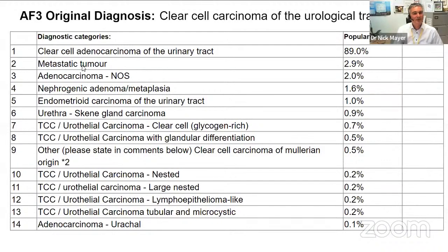But this was in a diverticulum, so I think it'd be harsh to call that 0, but maybe a half if people don't think it merits full marks. And adenocarcinoma NOS, a few fence sitters here, which is kind of not wrong, but it's not completely right. So maybe half marks for that.